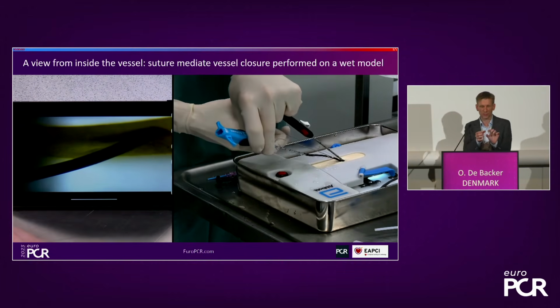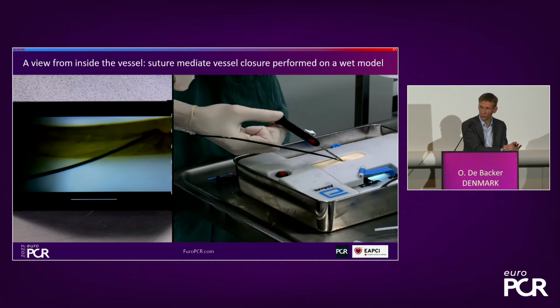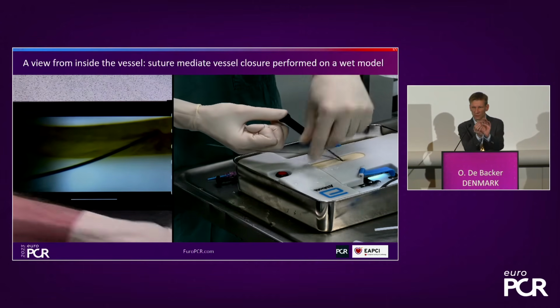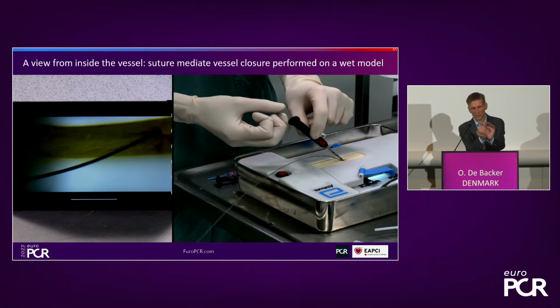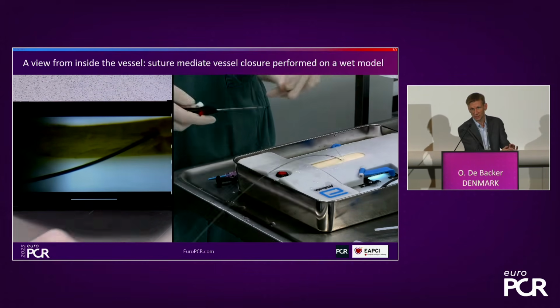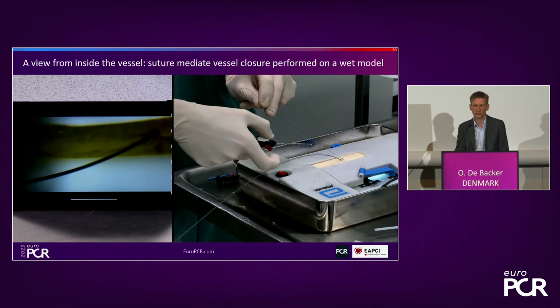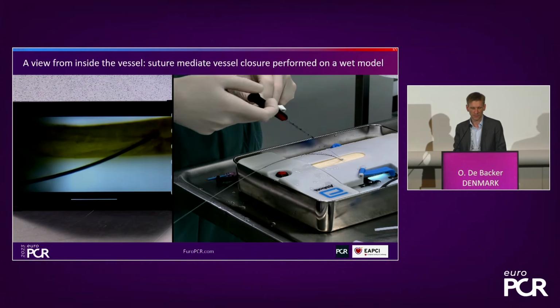And that's also the thing, when you move in at the beginning and you see the bleed back, don't go 2-3 centimeters deeper in, then you're far too deep. It's more like, when you do this at a not too fast pace, you go in, you see the bleed back, and then maybe advance 5-6 millimeters. But that's enough. Don't go 2-3 centimeters in, because that's too far. If you then open your anchor, you only increase the chance that you hook up behind all kinds of calcium, which is higher up in the vessel.